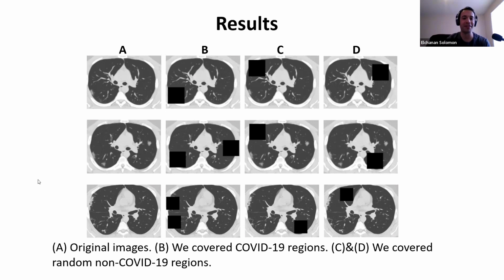Okay, please continue. So now, interpretability is the key thing of our study. You can see 3 COVID images, and you can also see the COVID regions: this is the COVID region, this is the COVID region, and over here, this is the COVID region. If you hide the COVID regions, then our model tells us that this is a non-COVID image.